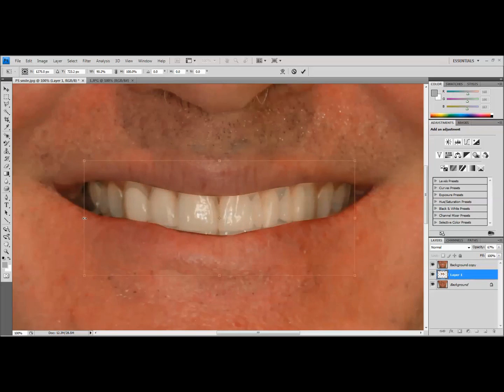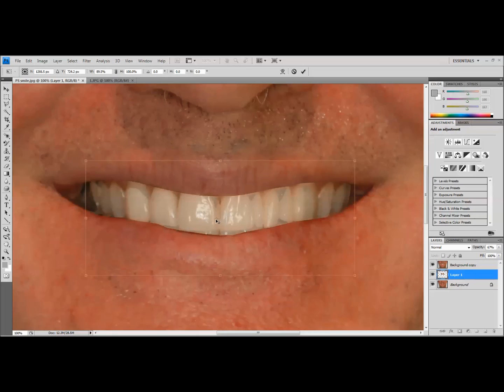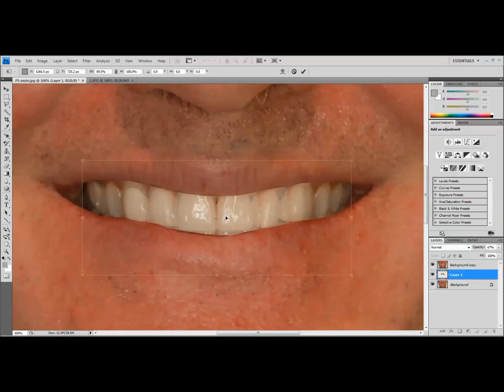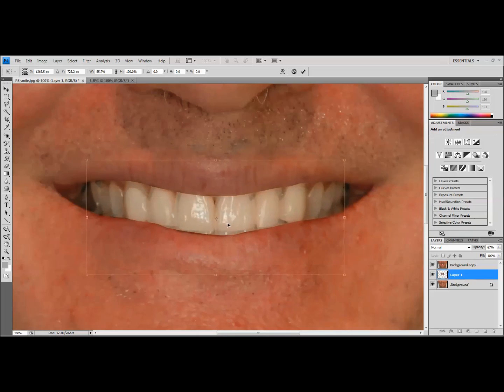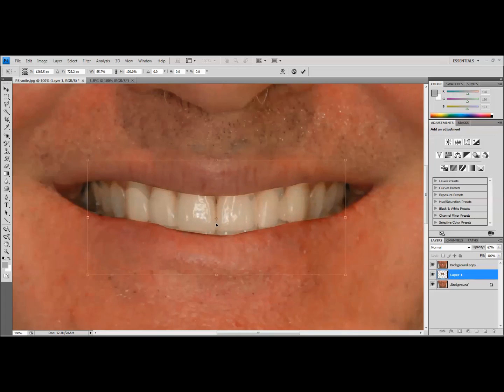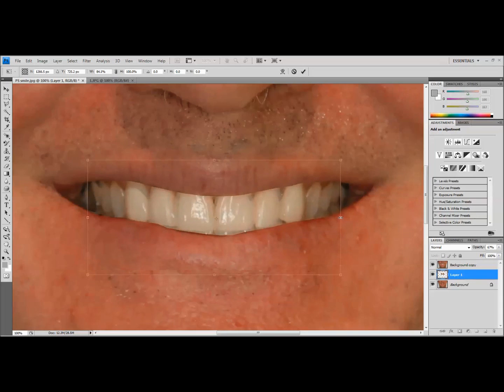And so I like to try and get the teeth lined up roughly similar to what their current teeth are. Again, we're resizing. I'm going to get the centrals where they're about the right width. I feel like that's always the easiest thing to do. We're going to keep narrowing this. And I always come back and match up the embrasure right between the centrals. And as you can see, now we're getting really close. This central matches up exactly.